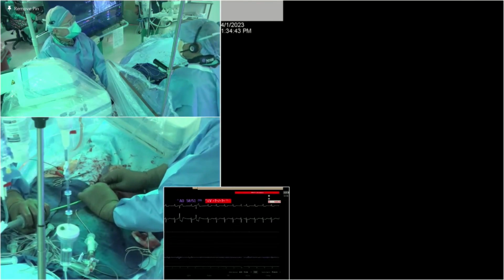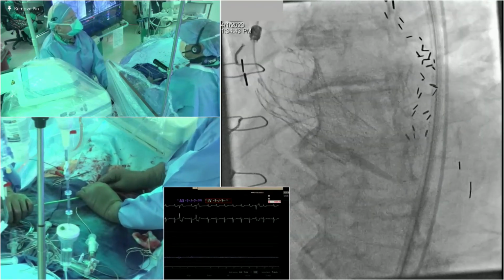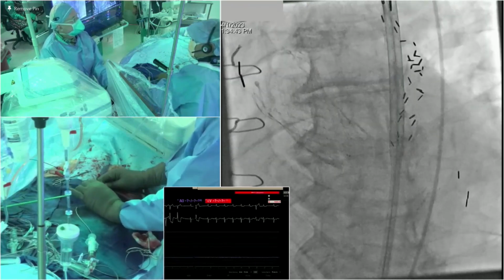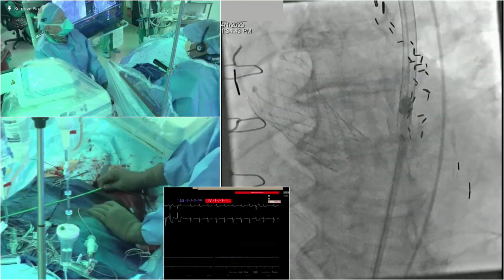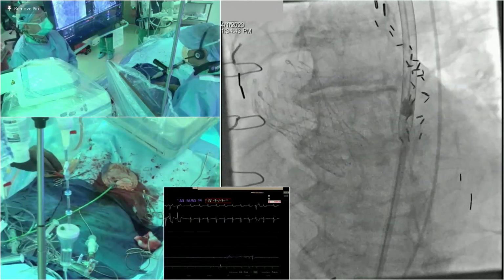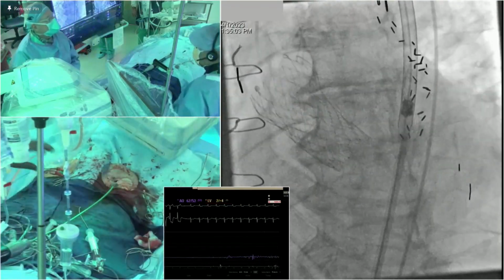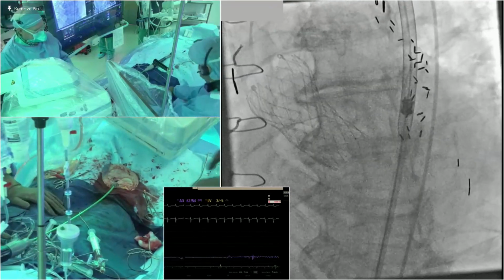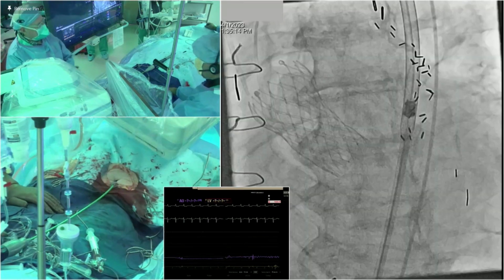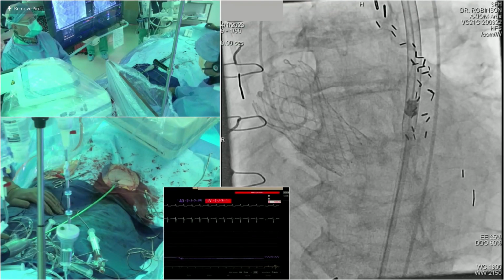No, it's off. I think it's off both. I'm not sure. Now it is. Straighten the wire. Yeah. Okay. All right. So now the valve is deployed. No going back. Yeah. Okay. Want this one? Or we can do both. Shot with 10.